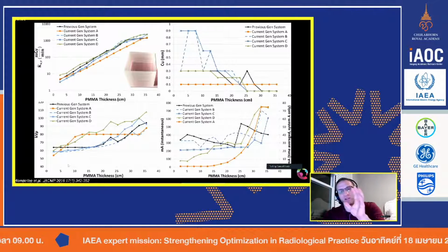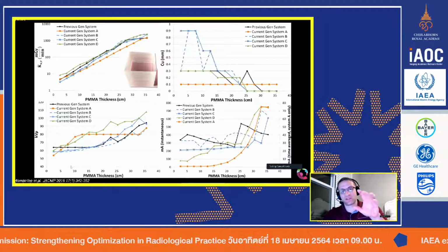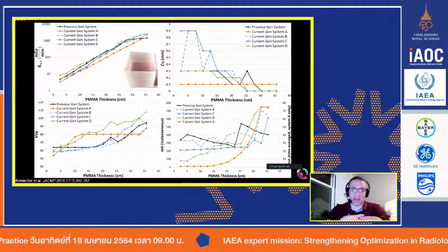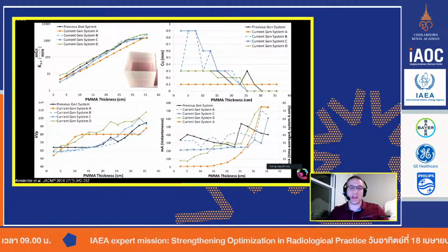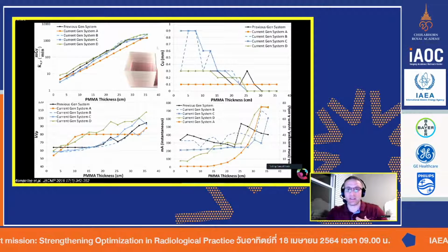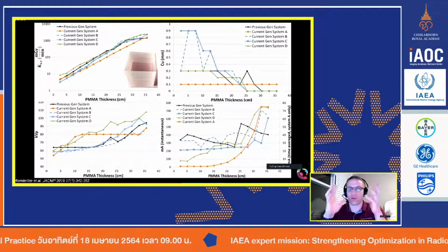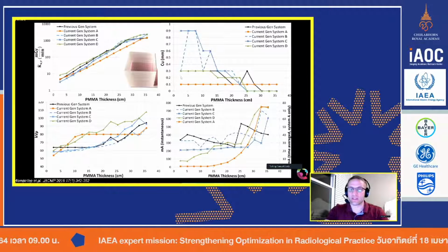So my point here is you've got to know your system. You need to know if your system is going to be, or potentially if a system you're going to buy, if you're doing all cardiac imaging in a pediatric center and you've got to see these teeny, teeny little vessels and it's going to be moving like crazy, I personally would not purchase System C at this high filter. Or if you buy System C, you're going to have to talk them down and see if they'd be willing to change their programming to allow lower filters at the smaller patient sizes.